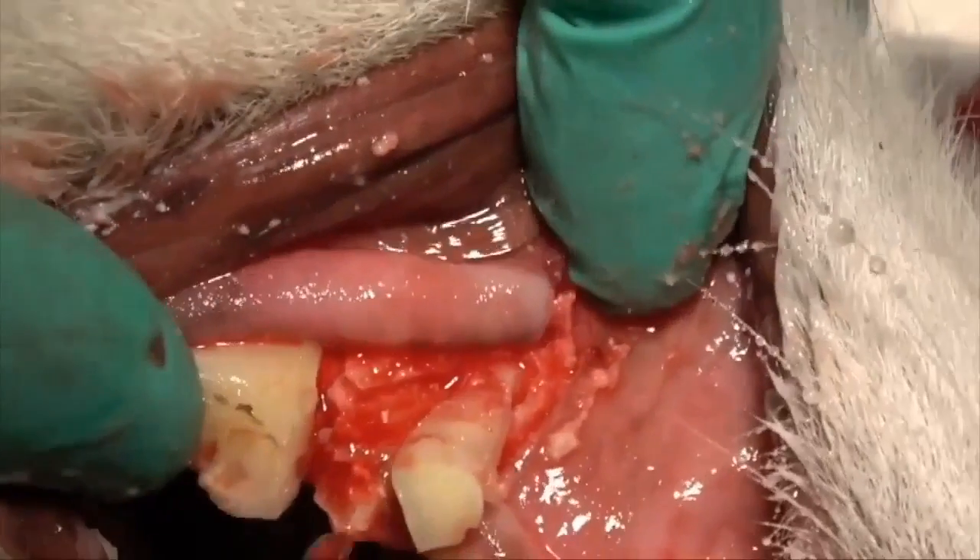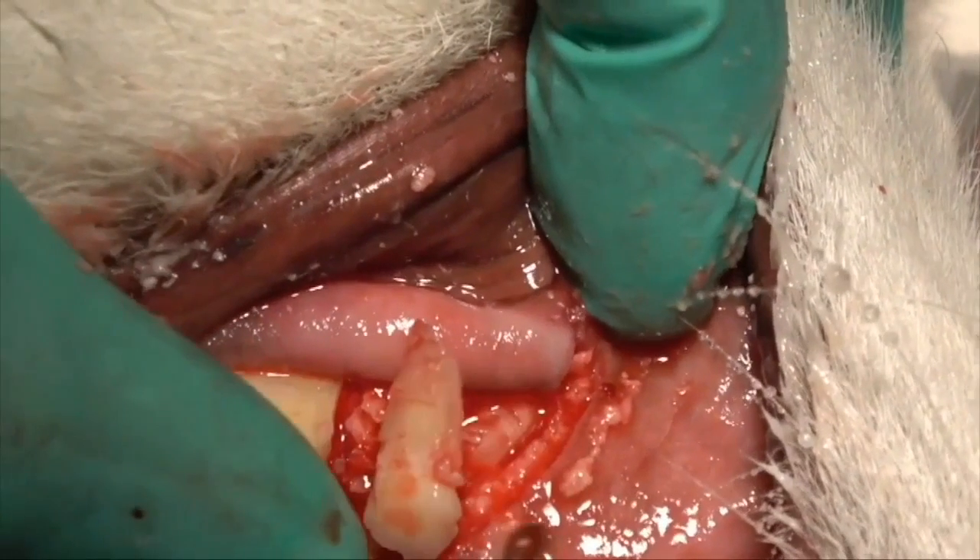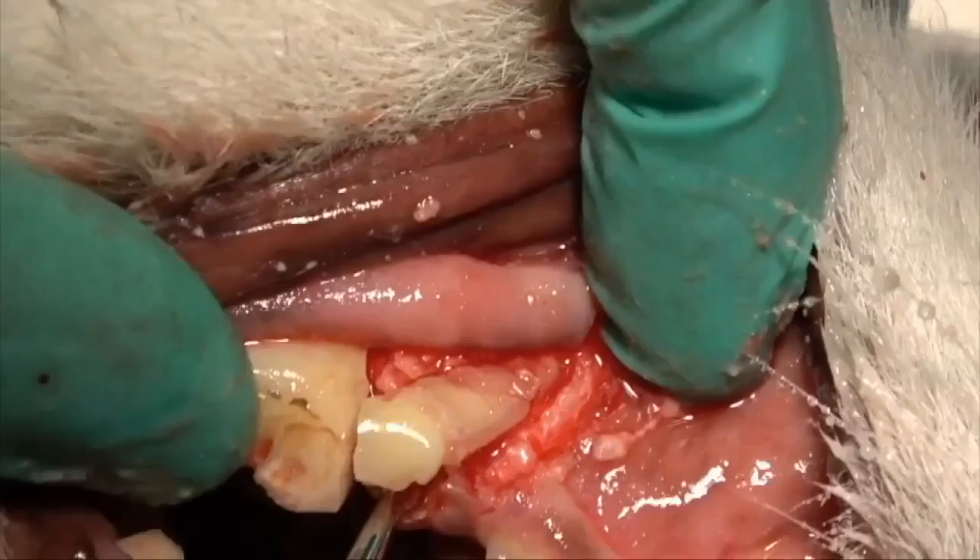Upon extraction, I fractured the mesial root on this maxillary right fourth premolar. You can see the root tip just to the right of the central portion of that root.